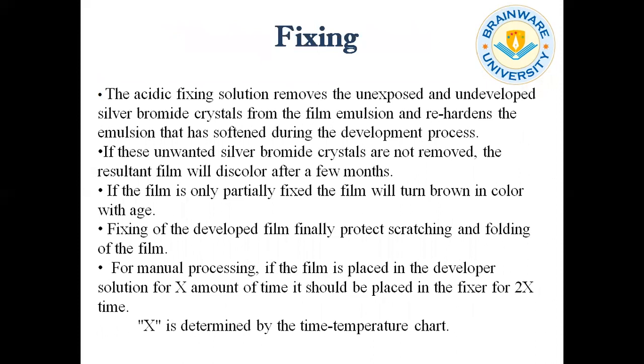So after that, fixing of the developed film plays again an important role. As we know, the developer solution is alkaline, and the fixing solution is acidic. So if we do not wash the film after development and put it into the fixer tank, it will neutralize the acid concentration of the fixing solution.